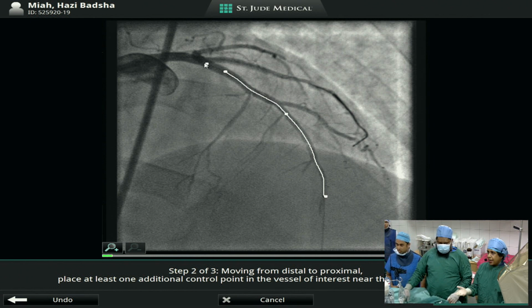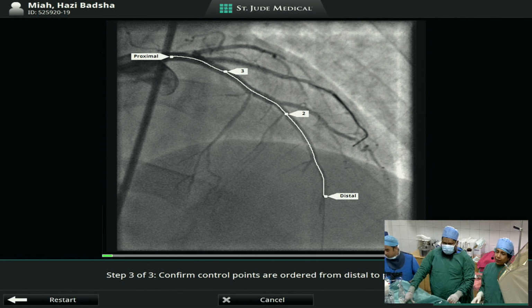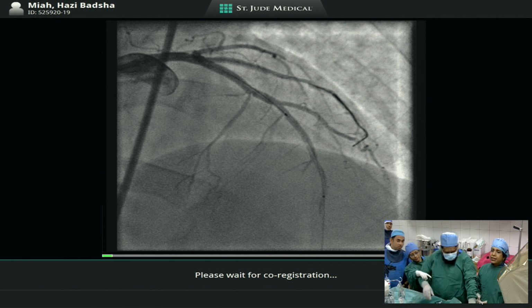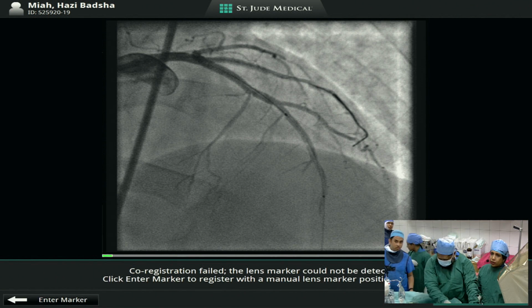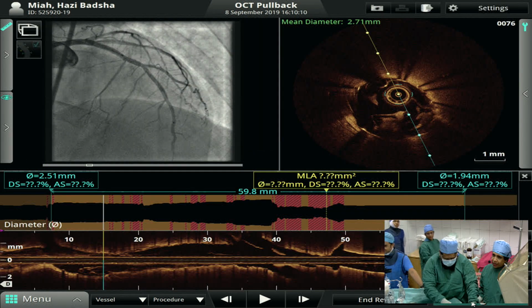2 OCT runs and a double stent technique for the left main. So that's pretty cool, actually. So I mean, now I'm becoming a believer. I was always a skeptic. I used to think, okay, with OCT you need such a lot of dye, and how can you use it in a patient who's got compromised ejection fraction? You can do it if you sort of strategize.